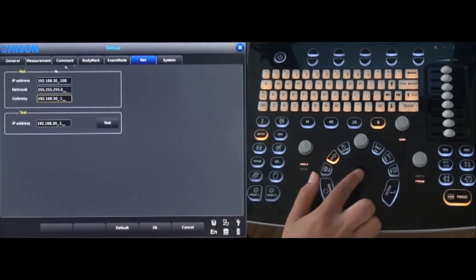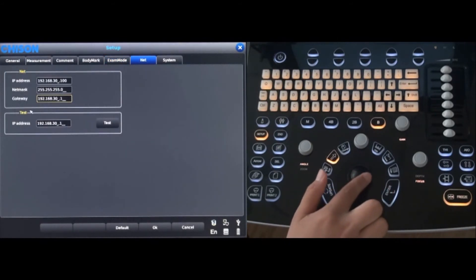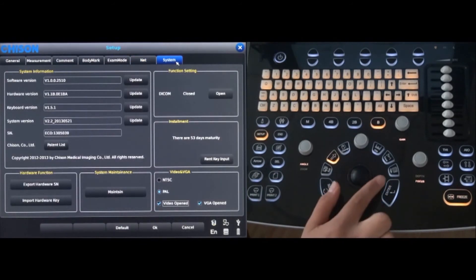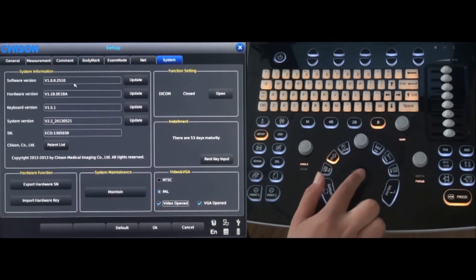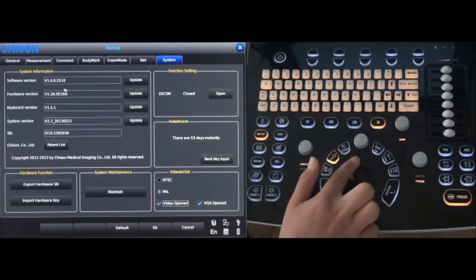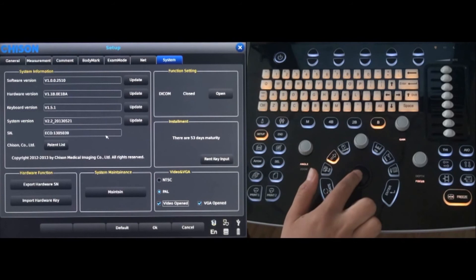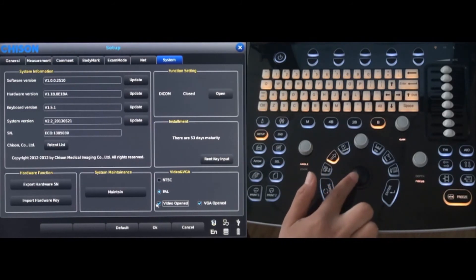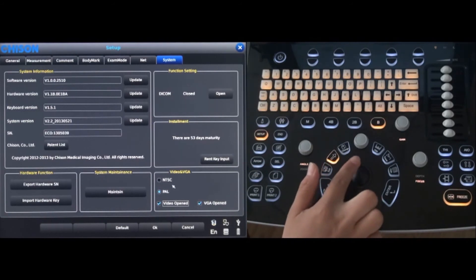Under the Net tab, network information can be changed. More advanced system settings can be changed under the System tab. Updates can be made for the software, hardware, keyboard, and system. Video and VGA ports can be selected if connecting a video printer.